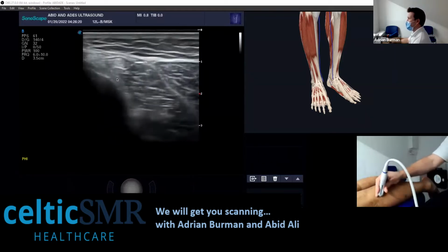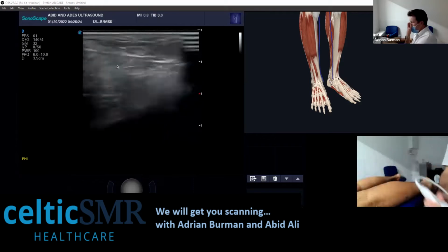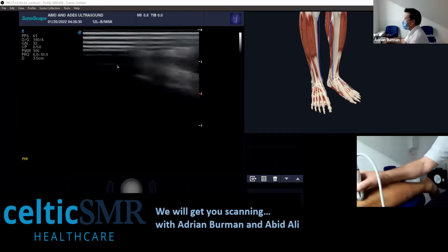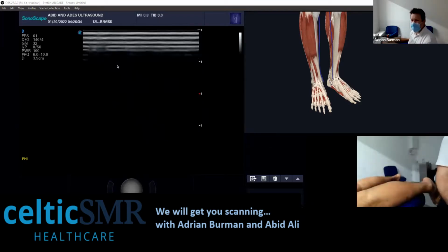So just look at whether it's thick and swollen, hypoechoic, and whether any cyst around it is compressing on it. Yeah, it's a tricky one. I don't see many of those. But I think the thing to look out for is basically if you get that drop foot appearance, it's an idea to go and just interrogate the peroneal nerve.